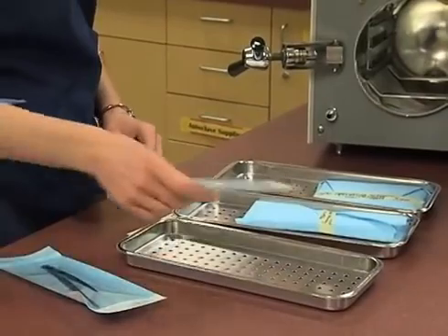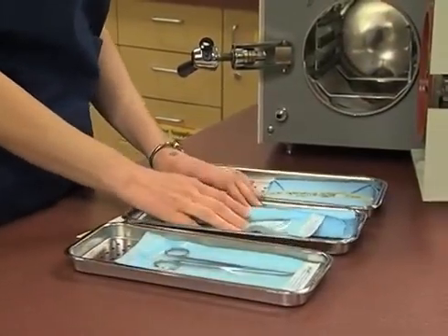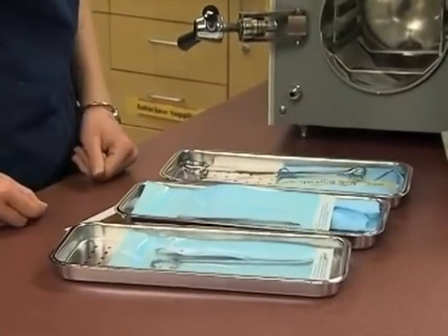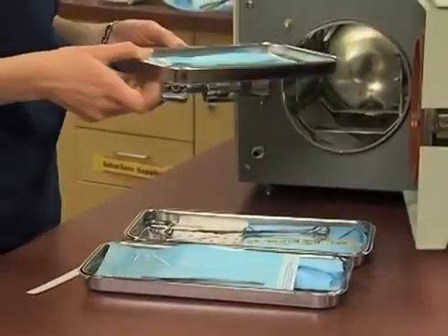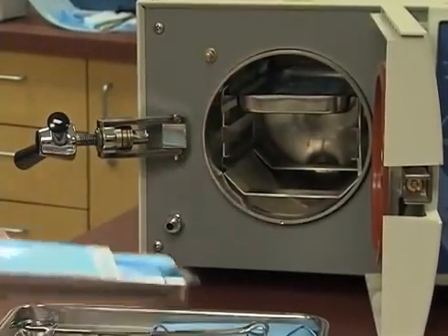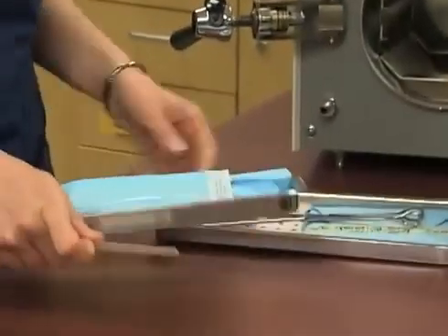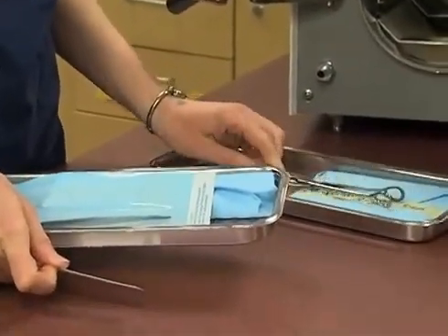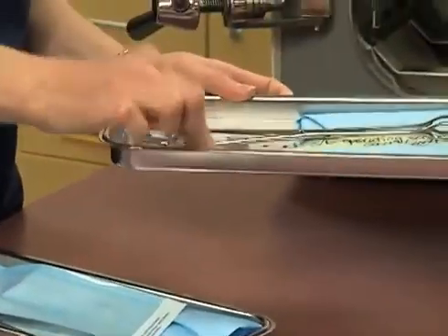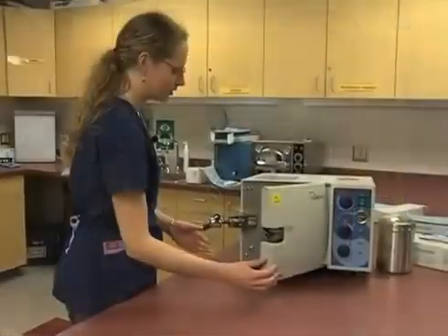We would want to make sure that we organize our items in our trays so that this is going to allow for enough air to move around. I might be able to get a few more instruments in here, but this is actually a pretty small autoclave, so we don't want to push it too much. We're also going to include our indicator because we are including items that are not wrapped. So as we're putting it in, we're including the indicator for that instrument.